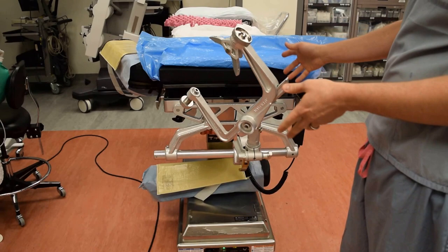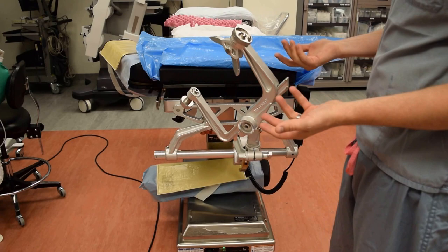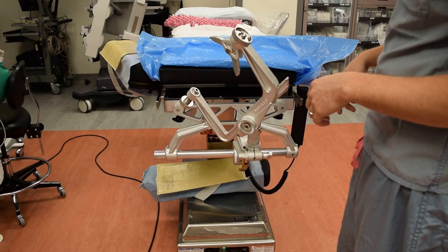When we unlock it, it's going to be the opposite — we'll start with the bar, then this position, and lastly this position. This way, the articulation starts from the top to the bottom, so we have minimal risk of jarring the patient while they're in a stable position in the bed.